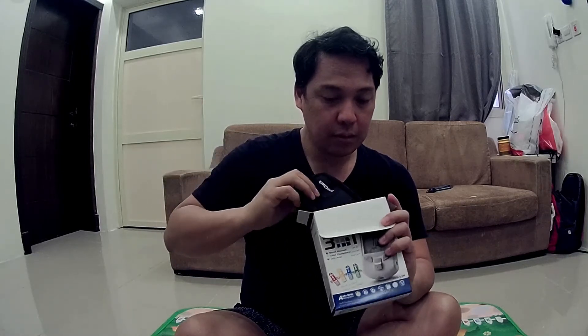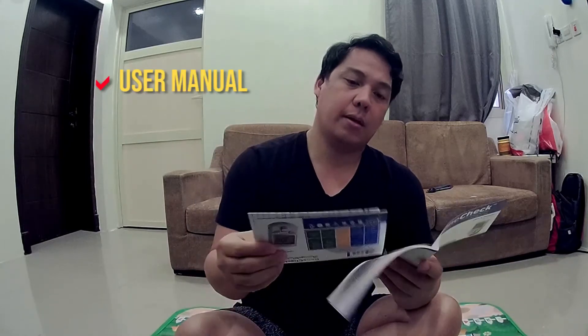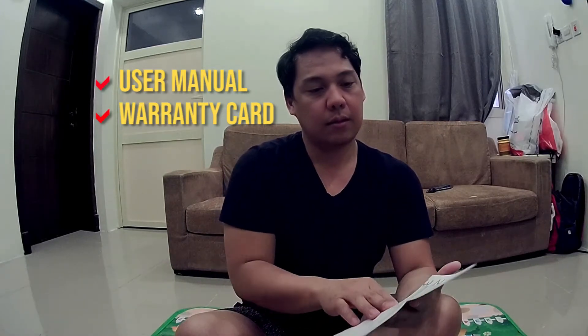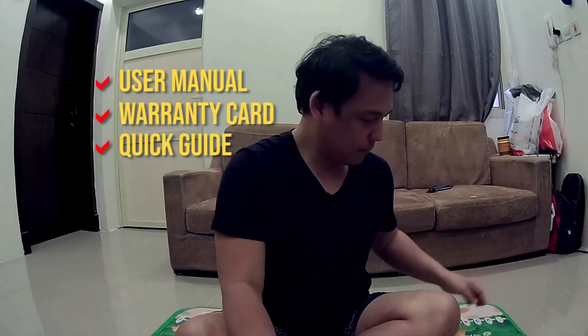Let's see what's inside this box. You get the BeneCheck multi-monitoring meter with the pouch — it's very light, it even feels like air. And you've got the user's manual, the warranty card, and the quick guide. That's it.